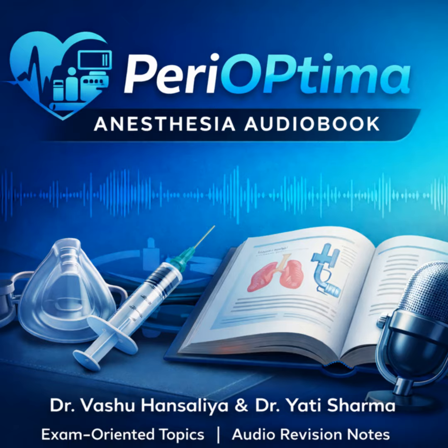Precisely. Electric to sound to send the signal, and then sound to electric when you receive the echo. That is the piezoelectric effect in a nutshell. Okay. I think I can explain that. Now, once that sound is in the body, what happens to it? Why do bones look white and fluid looks black?